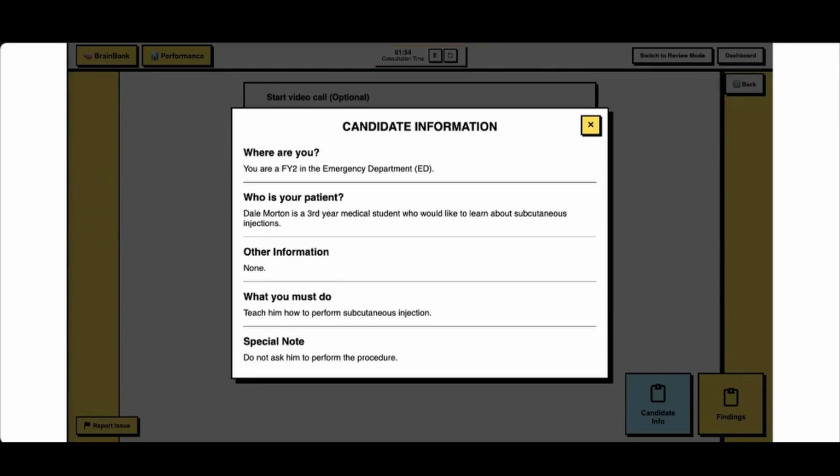So the whole thing is you explain to the patient what you're going to do. I'm going to administer medication into your skin, obviously using non-medical terms most of the time. This shouldn't be painful, because it's not supposed to be painful, but you should just warn them that it could be a sharp scratch.